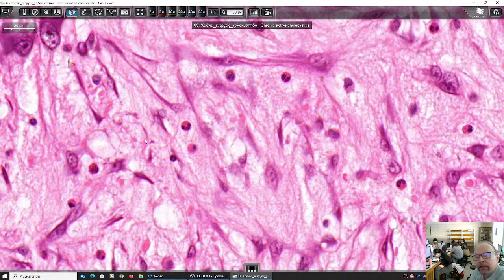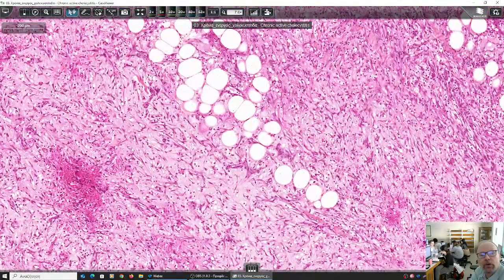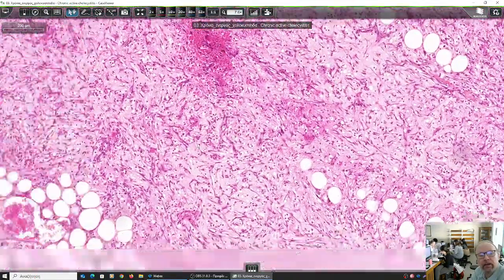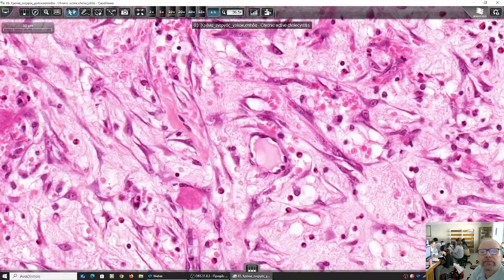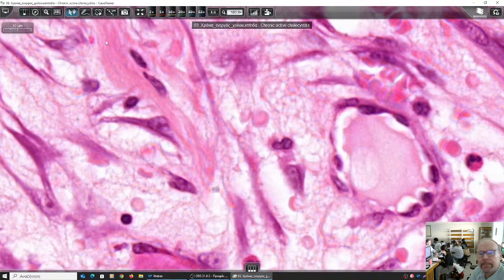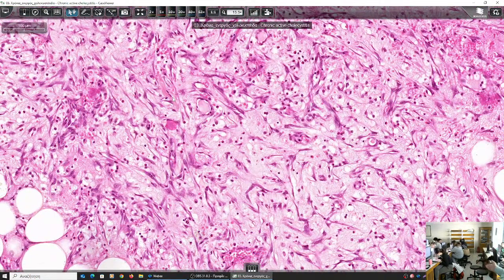And let's look at the collagen deposited here and causing all this thickening of the wall. Here it is. These are the collagen fibers. You see? These fibers are deposited by these cells, fibroblasts. As I previously said, what sign of inflammation is this? Desmoplastic reaction and collagen deposition. Chronic.